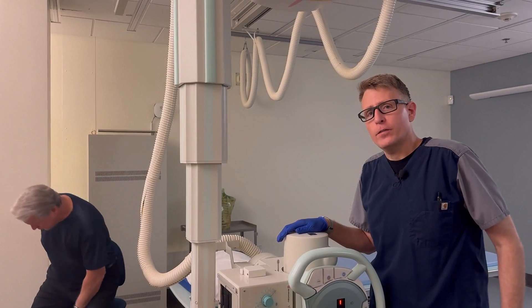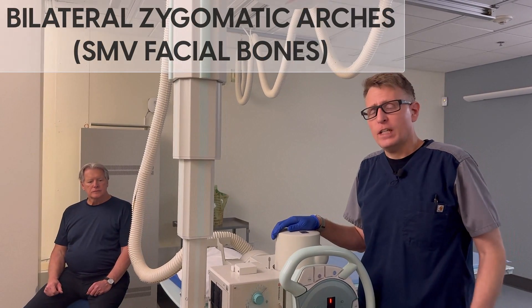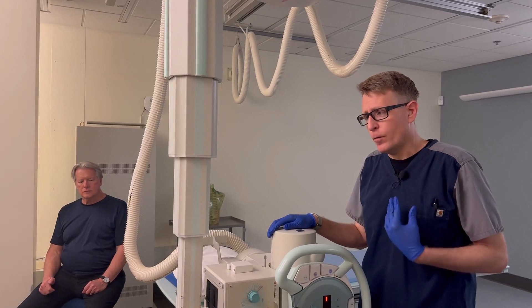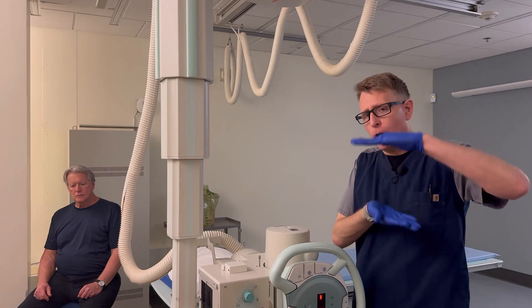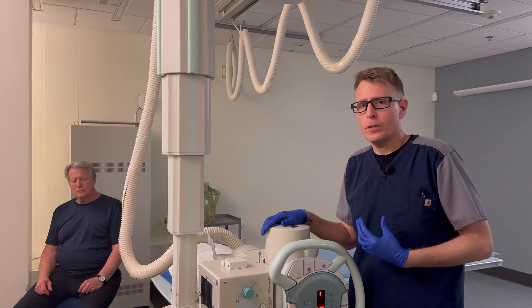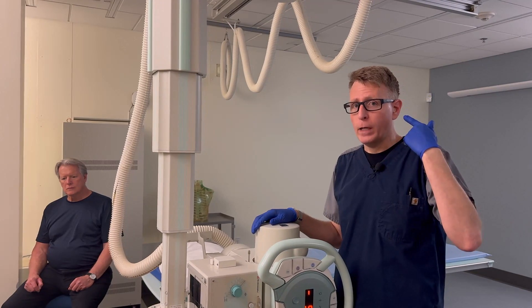Next up for a facial bone series is a bilateral projection to show the zygomatic arches. We're going to have our patient in the same position as if we were doing an SMV of the sinuses. Your area of interest is the zygomatic arch itself, which extends from the patient's cheekbone back to the EAM.